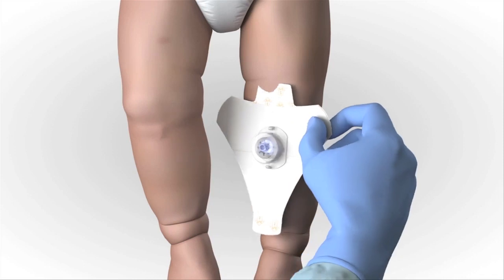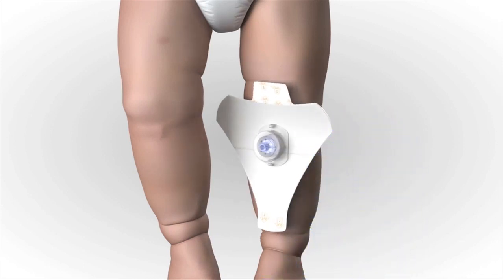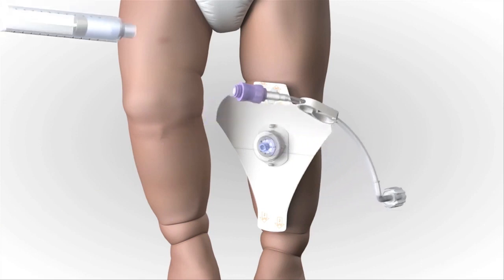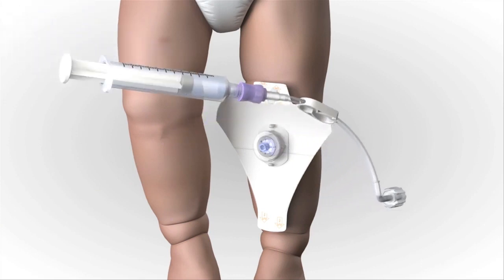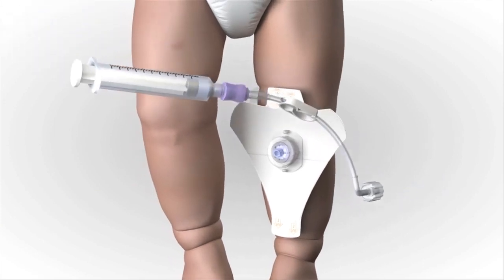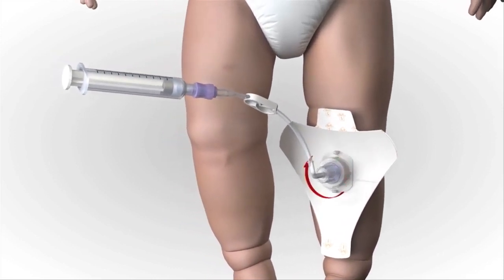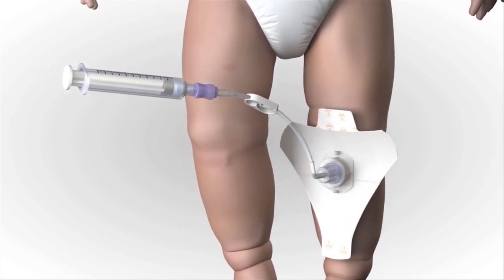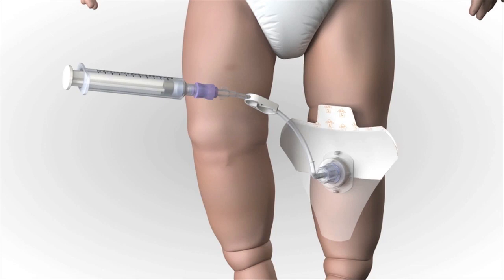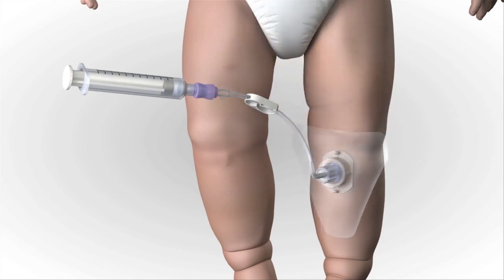Place the Easy Stabilizer dressing over the hub. Attach a primed Easy Connect extension set to the hub and firmly secure by twisting clockwise. Pull the tabs off the dressing to expose the adhesive, then apply to the skin.